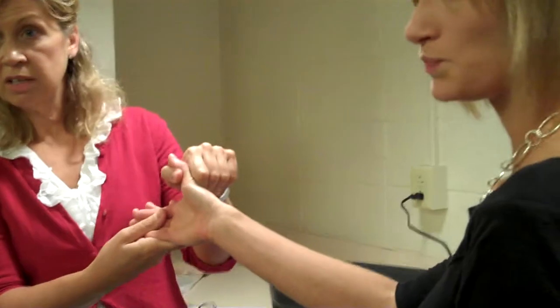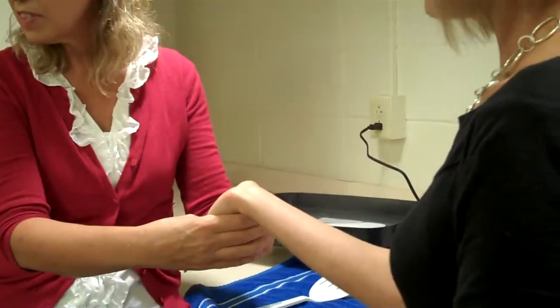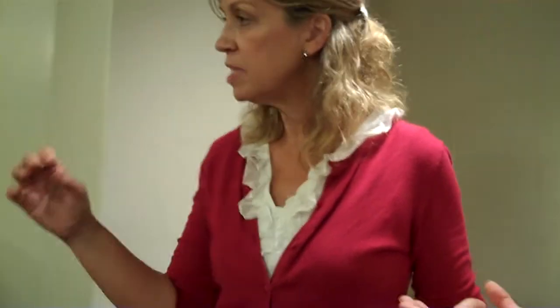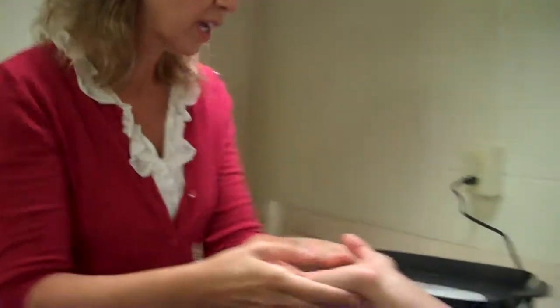Can you guys see that? Okay. And again, you don't want a lot of extension, but if you're asking them to use it during the day, you've got to have a little bit of extension to be functional. So don't splint them in necessarily neutral or flexion, then they won't be able to use it very well. Okay, you ready?